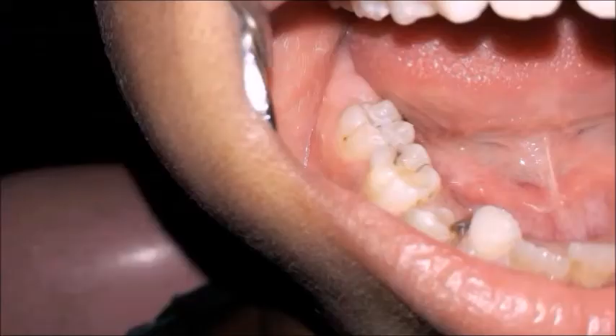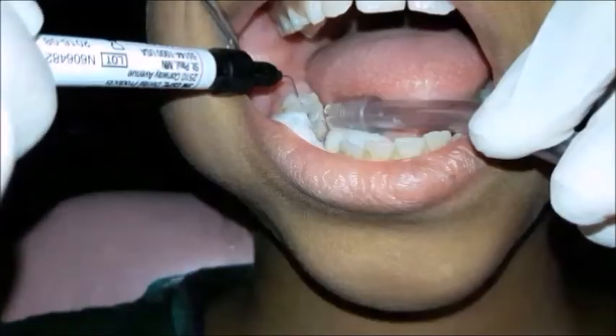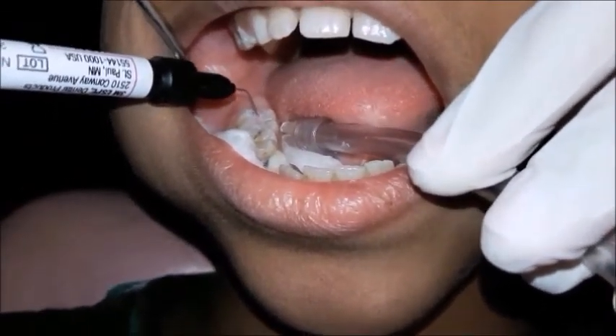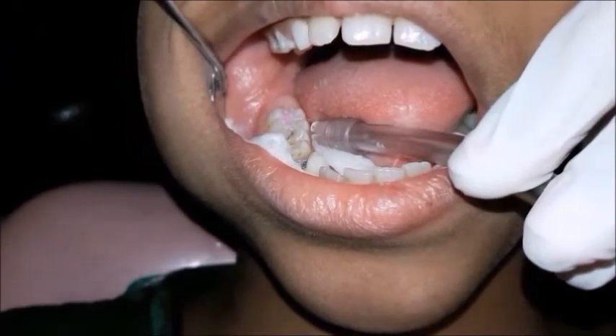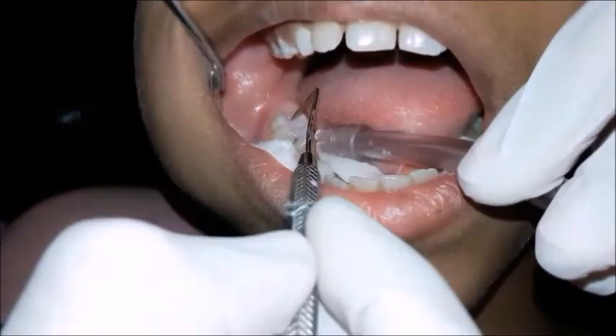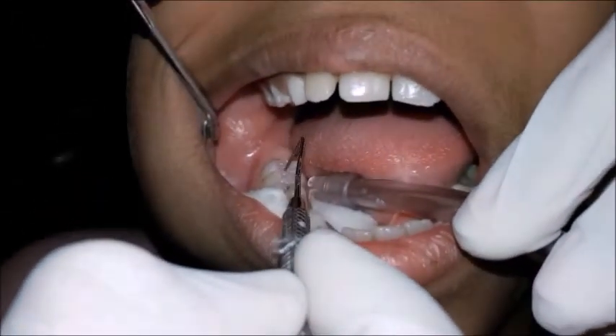After air drying, isolation is regained with the help of cotton rolls and suction. The next step is application of the pit and fissure sealant. The sealant is placed in one of the pits and then spread carefully in all the fissures with the help of a probe.